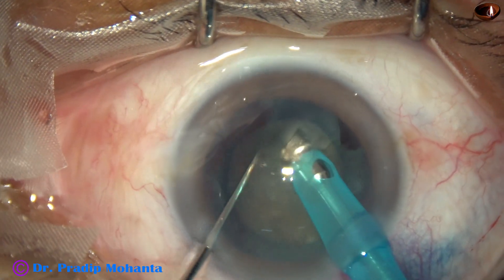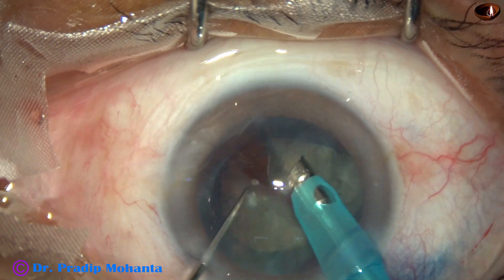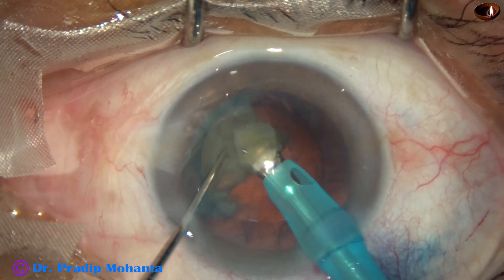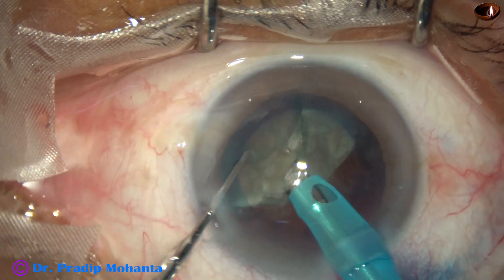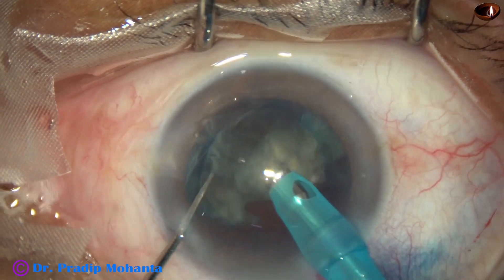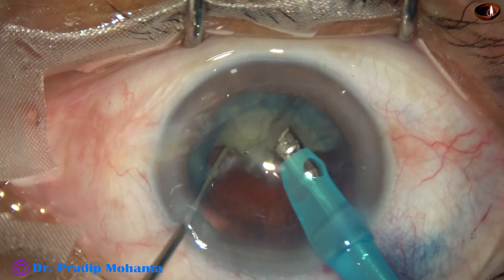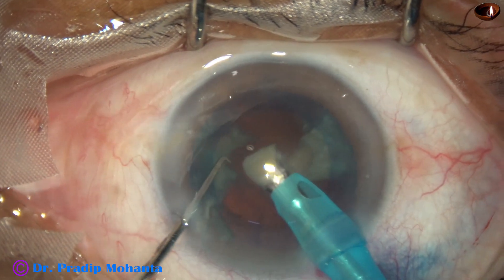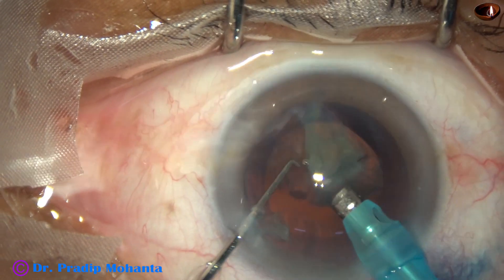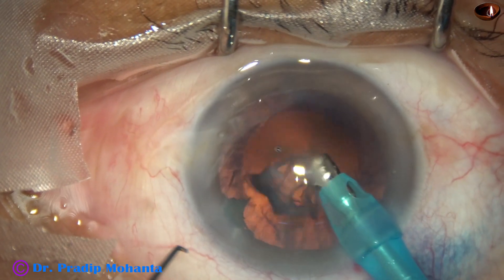I am chopping each hemi-nucleus into three fragments. I want to tilt this portion and manage this part of the nucleus. At this time I decrease the parameters so that I don't catch the posterior capsule.